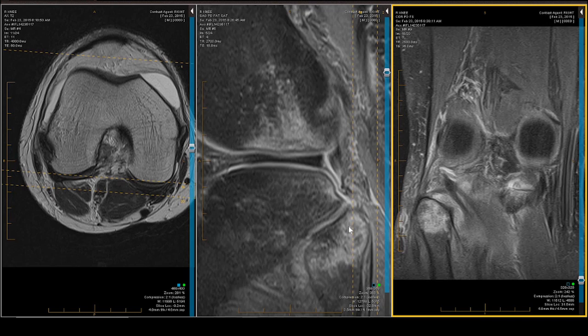In summary: we have an arcuate tear, a popliteofibular ligament tear, an ACL transection, and multiple micro and macro trabecular bone injuries including real fractures of the lateral femur and fibular head, with relative sparing and mild injury of the posteromedial corner, and sparing of the PCL. I would weave those key points into my conclusion. The soft tissue swelling and more minor findings go in the body. The only other pertinent negative I'd put in the conclusion is the status of the menisci, which were spared.